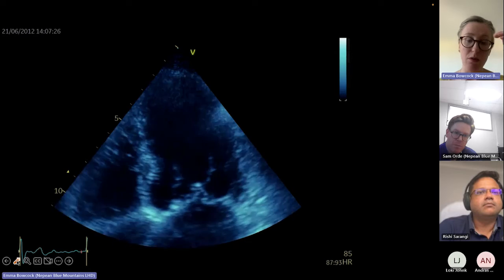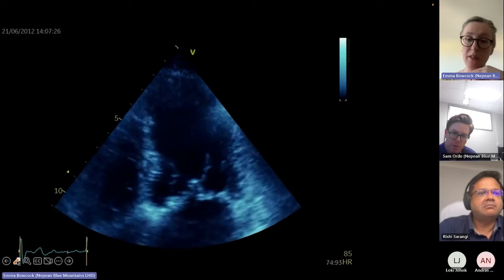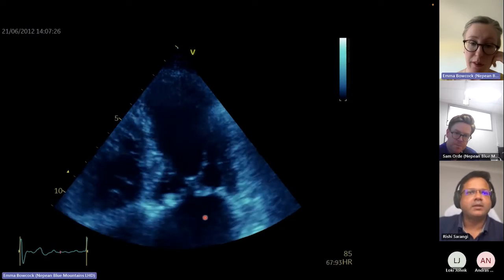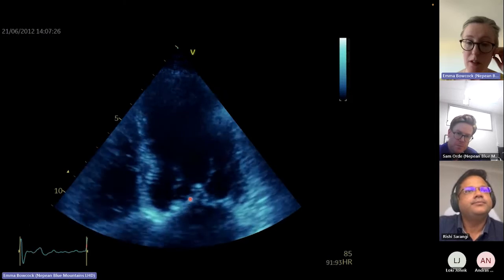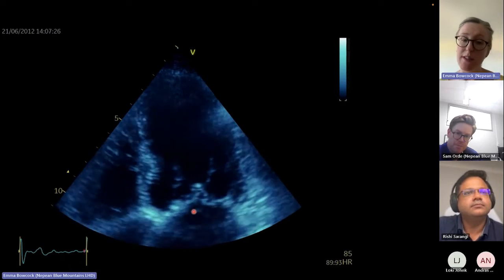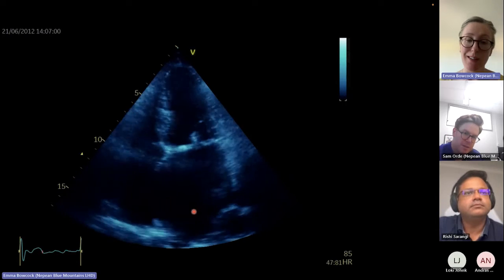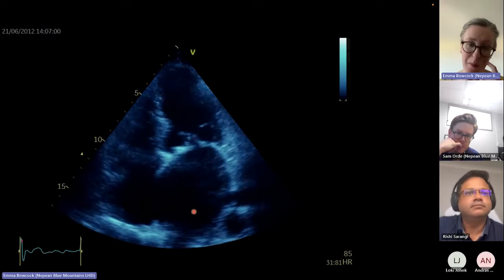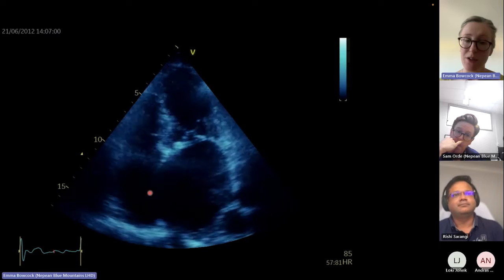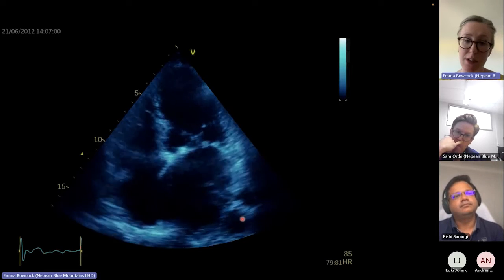Just to give you a feel for what rheumatic would normally look like. So preserved left ventricular systolic function, with thickening of the tips in particular, and severely reduced excursion in 2D. This is showing the ginormous left atrium. And of course, you'd be highly suspicious of raised left atrial pressure. Look at that bowing across there. This patient's going to have raised left atrial pressure.